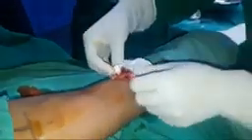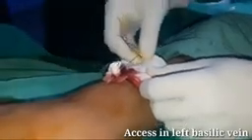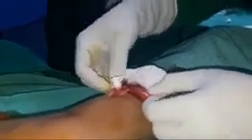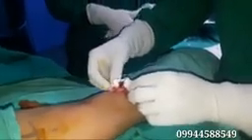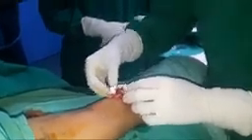We have taken access into the basilic vein just below the elbow region and we have passed the wire, so it is freely going. Now we will try to place a peel away sheath, pass the catheter, confirm the desired location, cut the size of the catheter, and then secure the catheter.